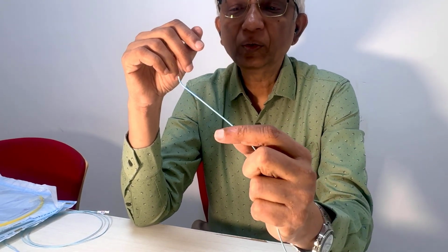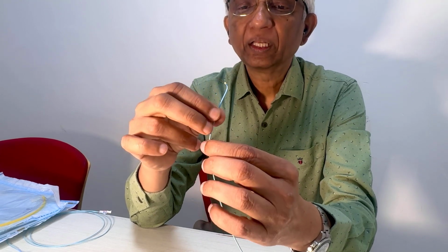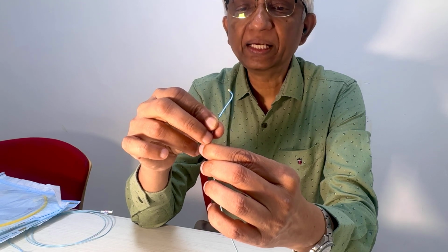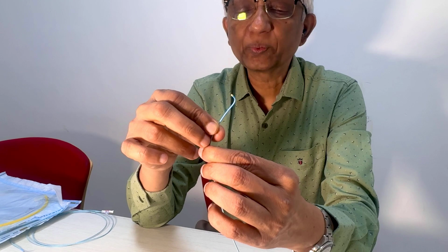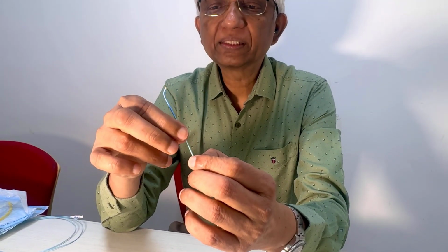You can come into the arch. You can easily enter into the right. If the arch is not unfolded or it is not a type C arch, in an A and a B, you can enter the subclavian as well as the left carotid. So we use it a lot. The vertebral artery catheter is another very, very good replacement for this. And the other catheter, of course, I said is a Judkins catheter, which especially when it is JR4, for a large arch, you'll find that this also works, right?